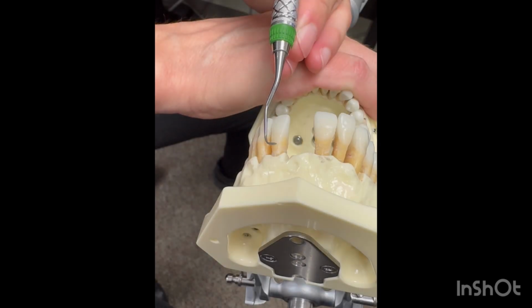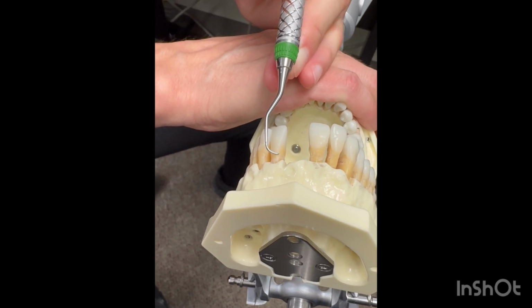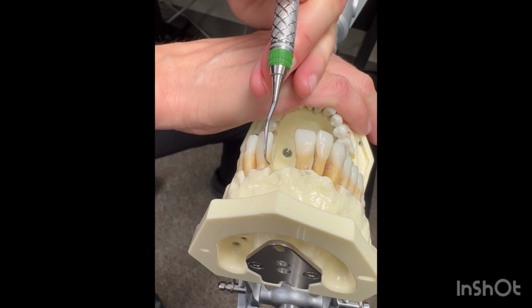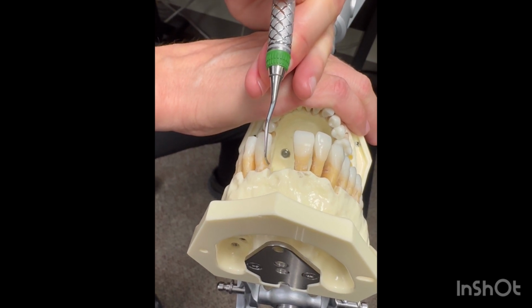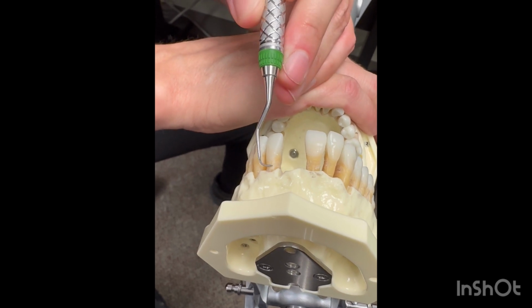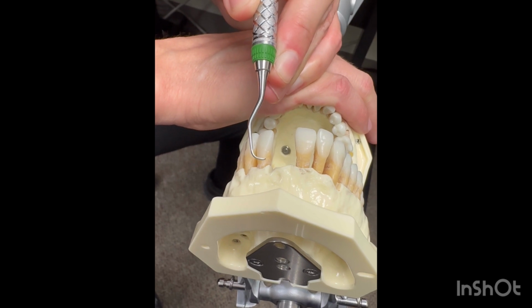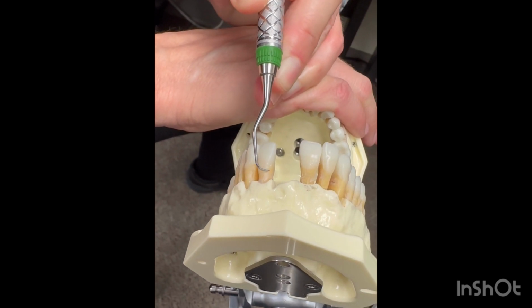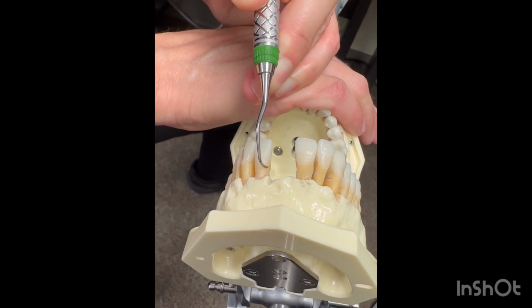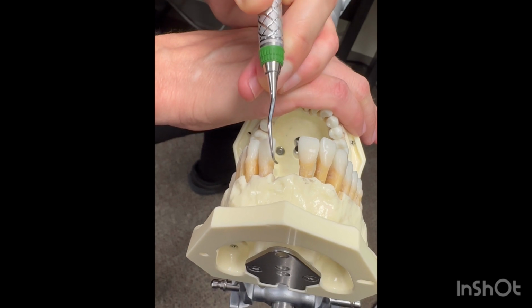Here Janelle is scaling tooth number 10 with the 5/6, which again would be appropriate for 1 to 2 millimeters of bone loss. We would scale the direct and interproximal surfaces, starting with the toward and the away surfaces. It's important to remember, since incisors are smaller, they're typically harder to adapt. So to ensure we have good adaptation, we want to make sure to have a good fulcrum and lateral pressure to maintain adaptation while scaling these teeth.